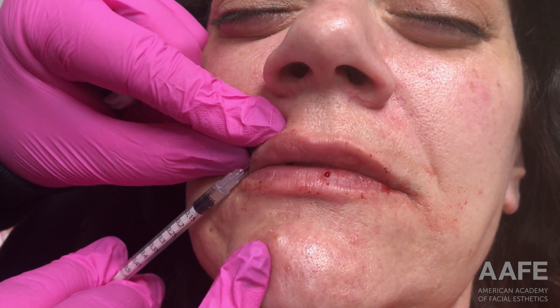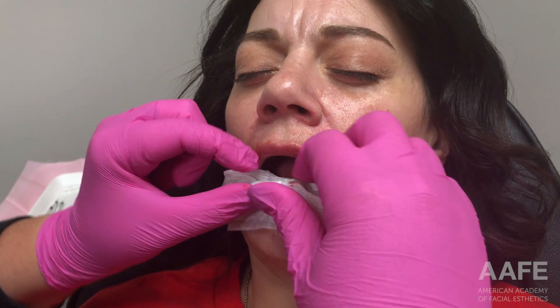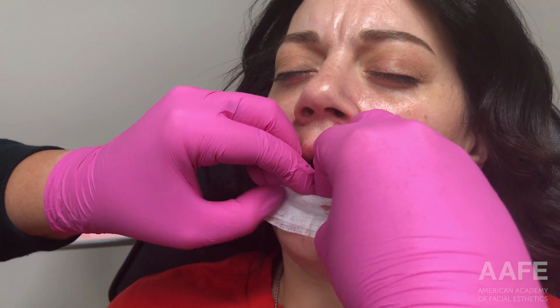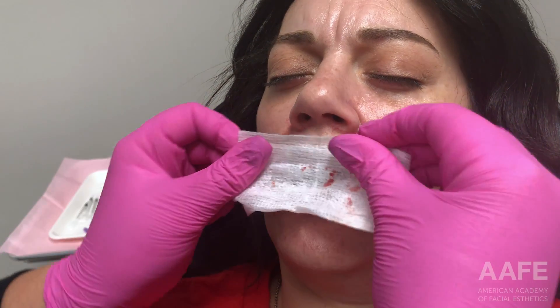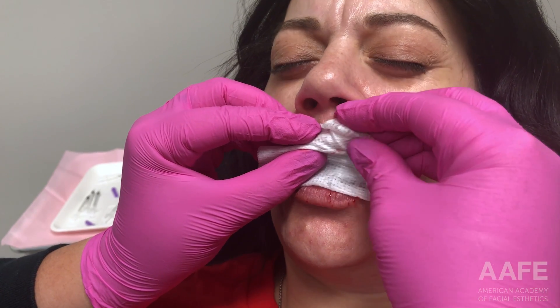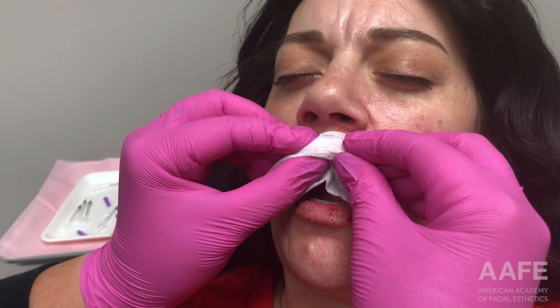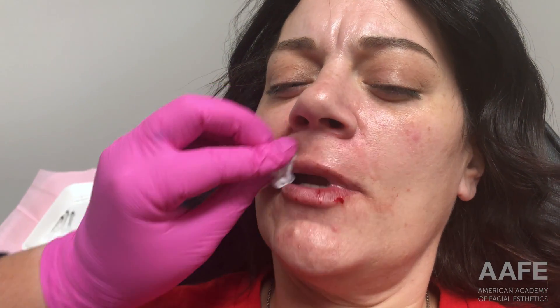Before I finish any lip enhancement, when I know I only have a little filler left, that's when I go in and massage everything so I can get a really good picture of what the patient is looking like, and then do little touch-ups. I always sit the patient up, ask them a question or two so I can see them talk and see how the filler moves in the lip, have them smile, and really get a good sense of what the lips look like straight on and all the way around before doing any final enhancements.